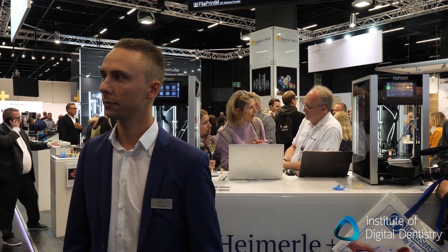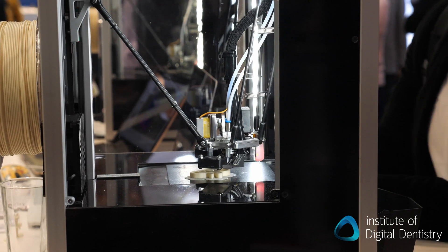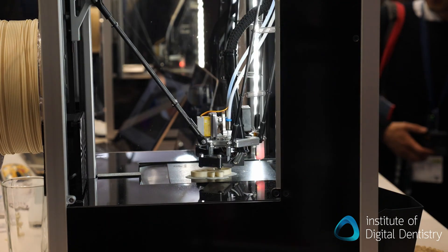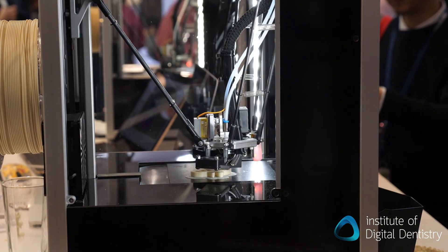I see a few different things from other filament printers on the market. What's unique about your printer? The unique thing is the drive belt, so you can have a continuous print. The first piece is already printed, it's ejected out, drives back, and then the next piece is printed. And the speed is unique.